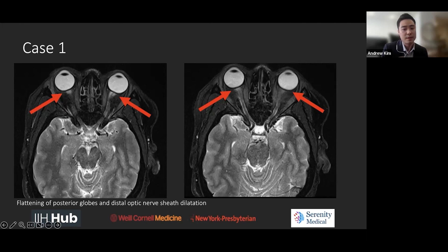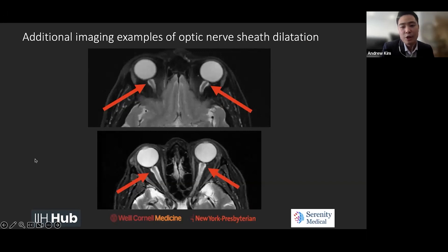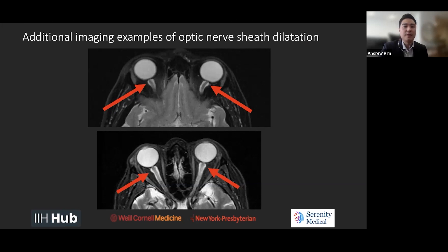So the CSF space is sort of distended distally there. Here are other imaging examples of optic nerve sheath dilatation in other patients with proven IIH. You can see that there are varying looks to it.